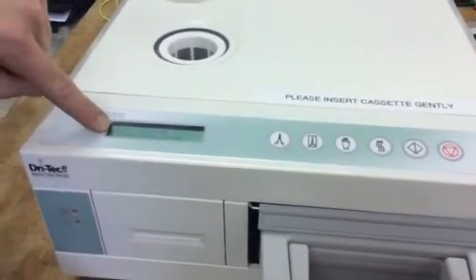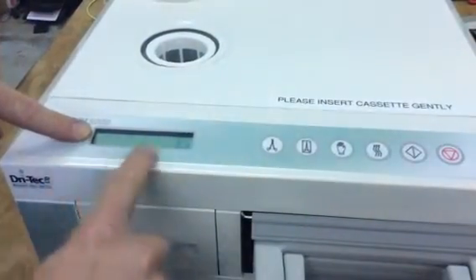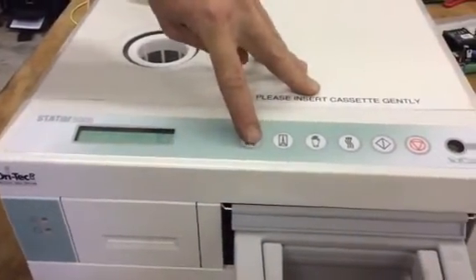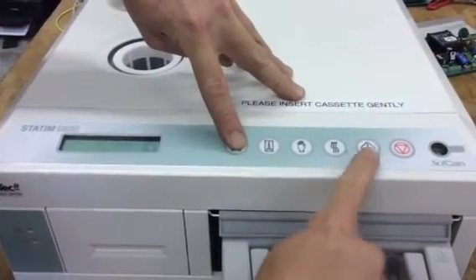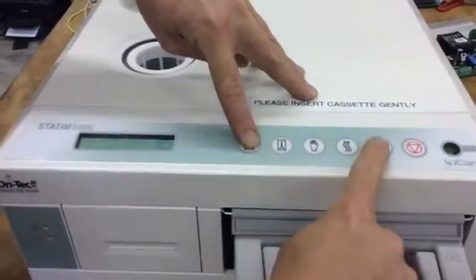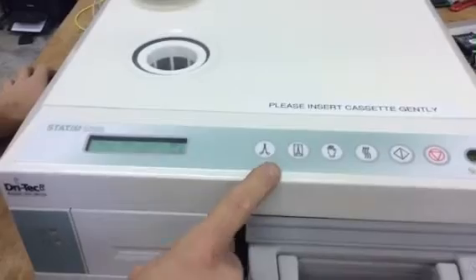Once that arrow is on calibration, hit the glove button. Once you hit the glove you should see a screen like this. Then you're going to hold down the unwrapped button and hit the start button, and you're going to see a star pop up — that engages calibration, like you see right there. Now it is doing a validation calibration.